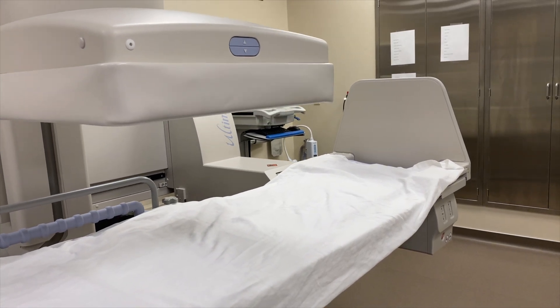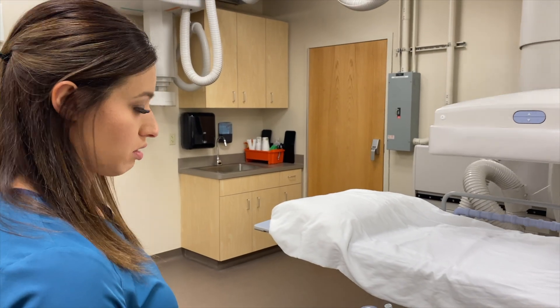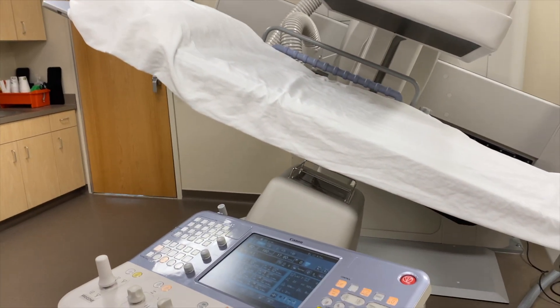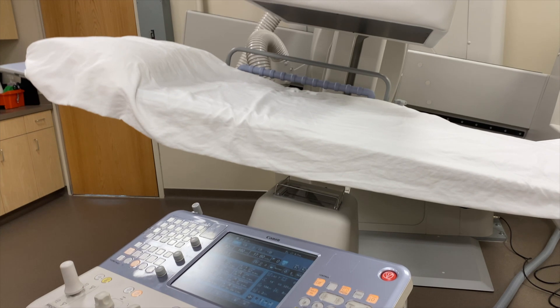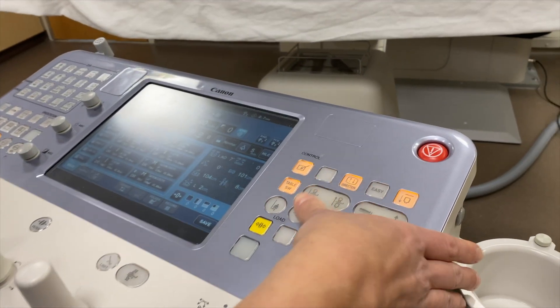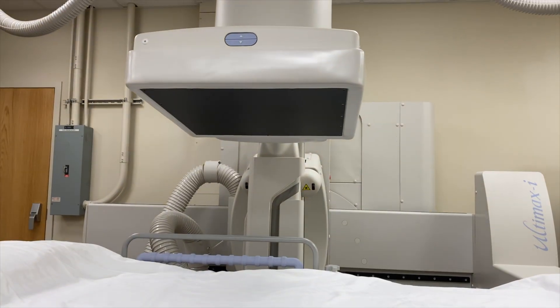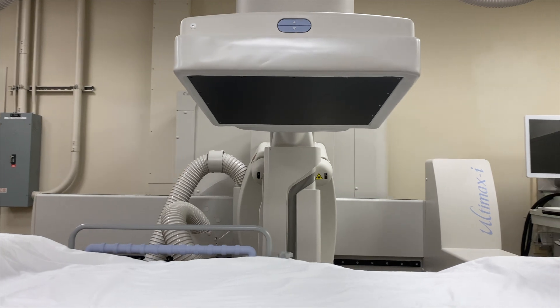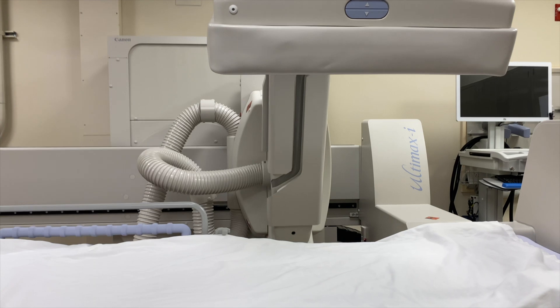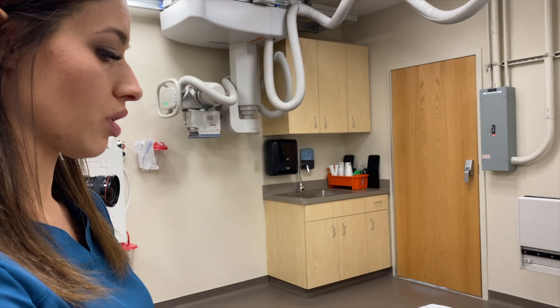We can raise the full machine if needed for a procedure. One of the nicer features is it saves a certain loading position, so the machine will automatically do whatever it needs to get to a good loading position for the patient. You don't have to worry about moving the C-arm separately or the table separately — it's automatically programmed to get down to the lowest position for the patient.